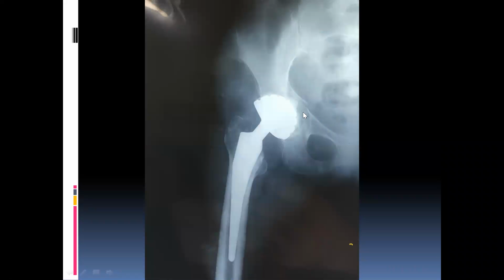When you can see this one, this outline away from the cup, this is the head. We use it to impact this graft from here to the inferior part, and we use a cemented type of dual mobility cup with a cementless stem.